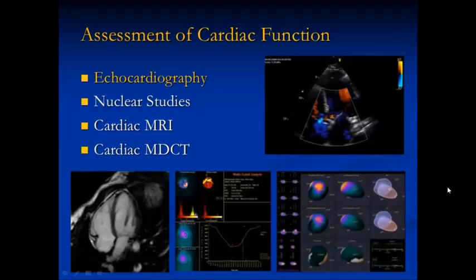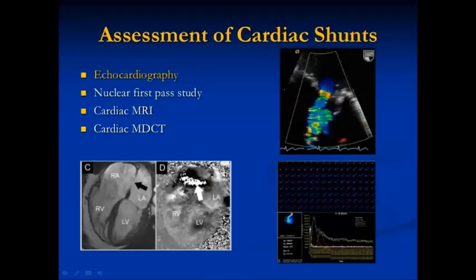Assessment of cardiac function. First step and very reliable data may be obtained from ultrasound examination. Then further information will be obtained from nuclear studies, cardiac MRI, and cardiac CT.